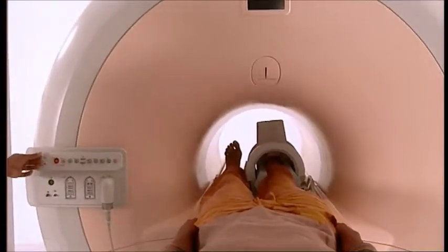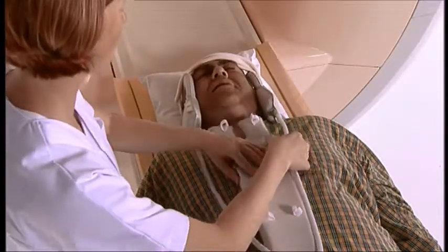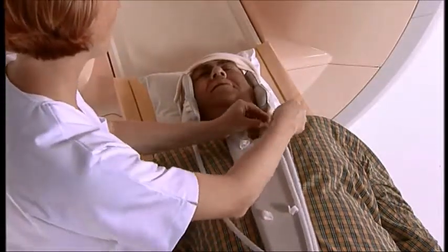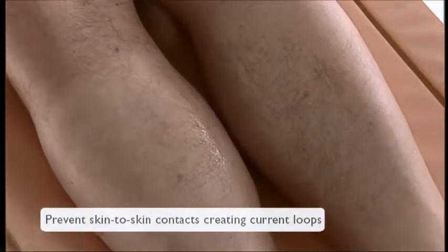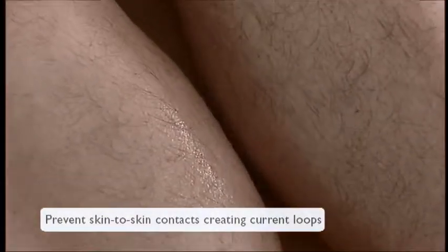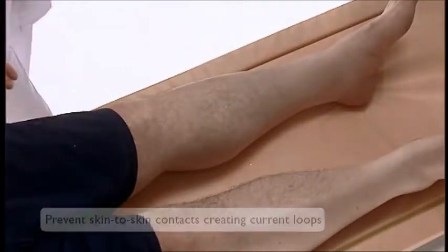Philips systems are designed to ensure the optimum separation distance, but under some conditions, for example if the patient's arms are within the scanner, extra padding may be needed. An unwanted antenna effect can also be caused by the interaction between cables or coils and the patient's body, or even between adjacent skin surfaces, particularly if the patient is sweating, as this increases the skin conductivity.